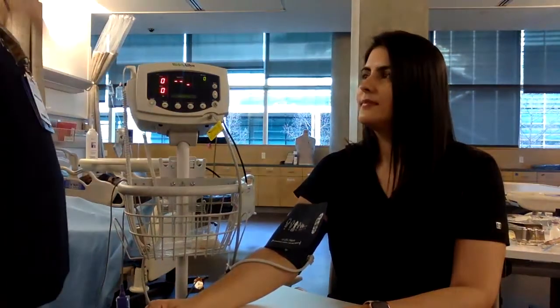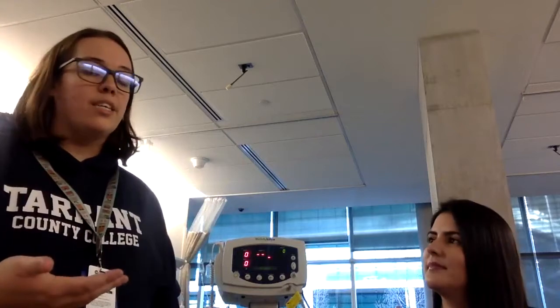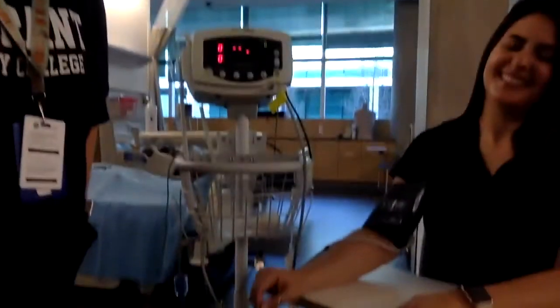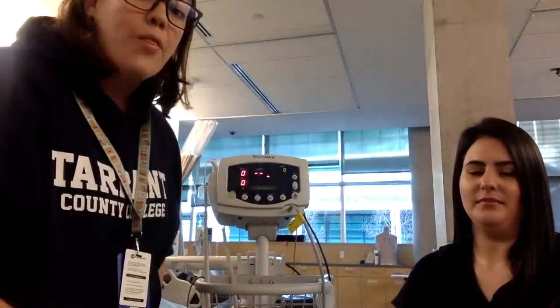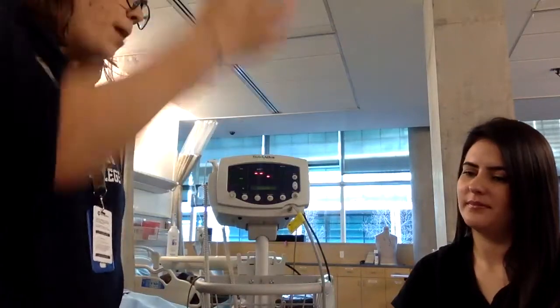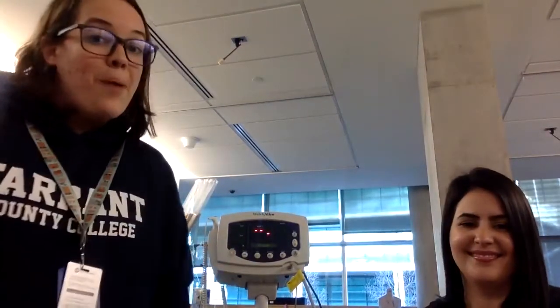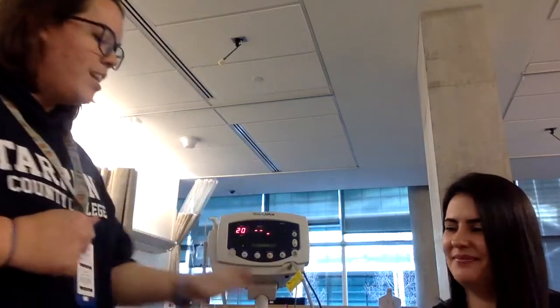Before taking blood pressure, you want to pick a good time. Don't take it if you just stressed the patient out or if they just went for a run. I want both of her feet flat on the ground and not crossed. I want her arm level on the table — not too far down or too far up, just straight and level with her heart. I'm going to tell her: I'm taking your blood pressure, so try to be still and quiet, because if she starts talking that's not going to help. So I'll start with the blood pressure.